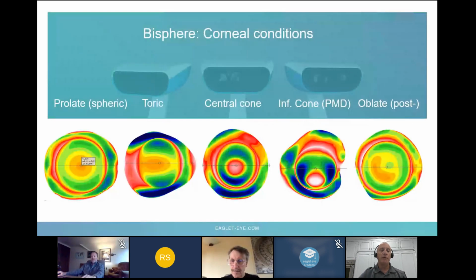We do want to observe, our eyes are still good and we have that experience, but this system takes that guesswork and that seat-of-the-pants artwork that we've done, and we're going more to the science and what's really there. That's what has opened my eyes in these last couple of years of working with the Eaglet, how different my fits are now compared to the past. But reducing your amount of refits? Correct.